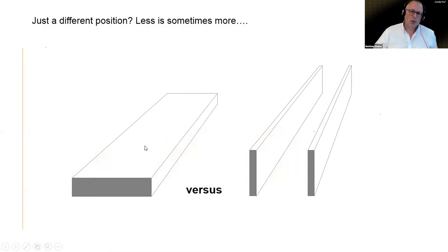Now usually when you show this for the first time to someone, and everyone who works in this region is used to dorsal plating, so to a plate that is attached from the dorsal side. We'll look at one of those plates. So this is one of those plates. There into the camera, so you actually see this. And the first thing that someone does, even I do this, right? Give me something to play with, and I try to show you how weak it is, and you find this very easy to bend. Can you see this? It's already bent.